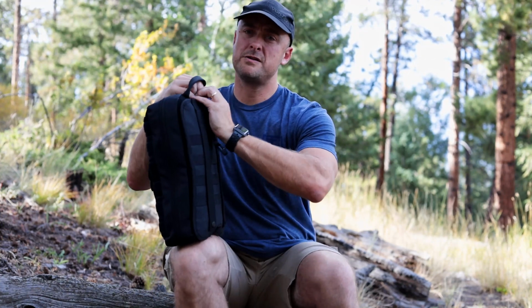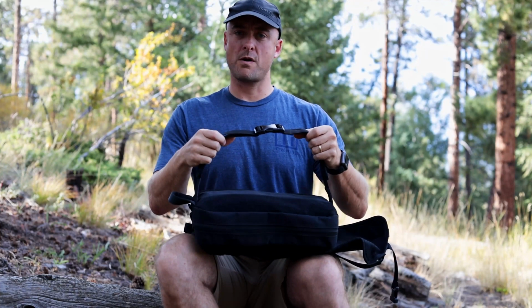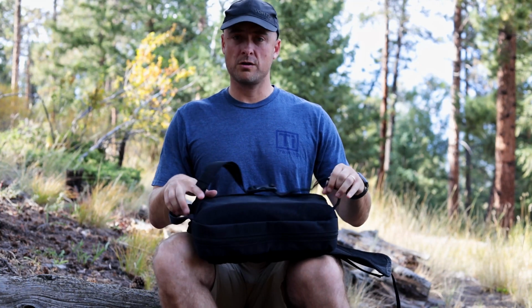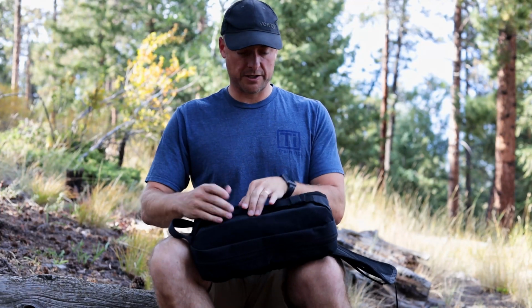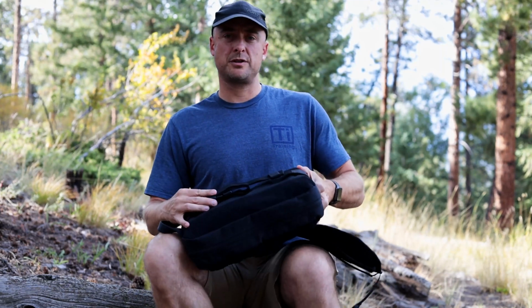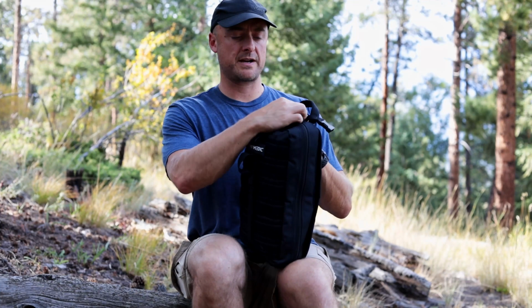Along with the one on the back, one of the things I like is when you undo this strap, you can actually tear this bag off, and it has a strap on it. You could either throw it over your shoulder or go old school like a fanny pack, and if it's attached to your car or something like that, you'd be able to tear this off and take it with you out to where you actually need to deploy it. So that's kind of a nice feature. I do actually like that. Just gives you a little bit more options on how to store it and still be able to deploy it quickly. All right, for opening the bag up, you have this strap on the front that actually helps tie it into the Velcro removable case on the back.